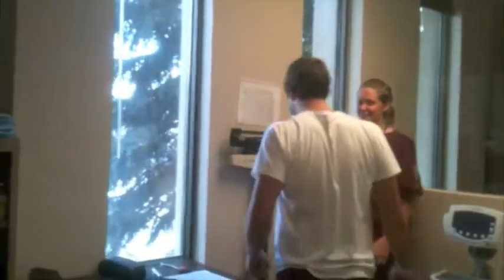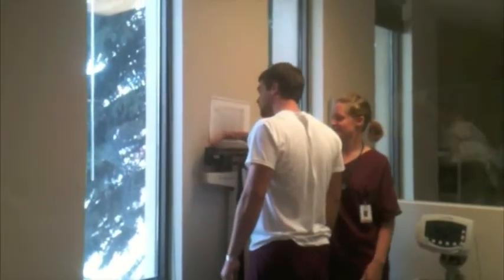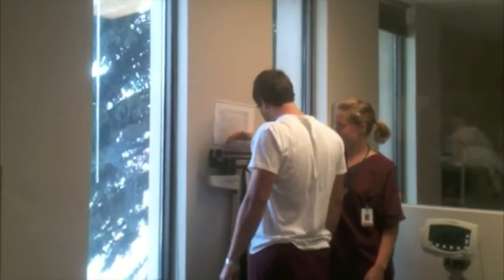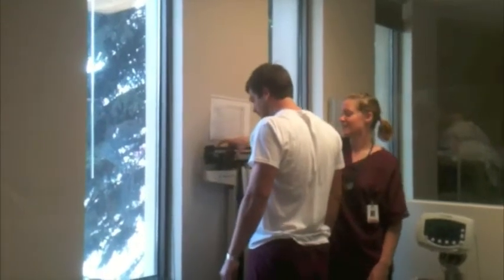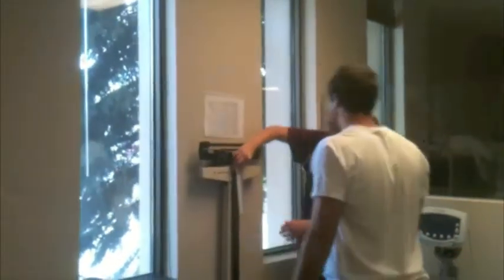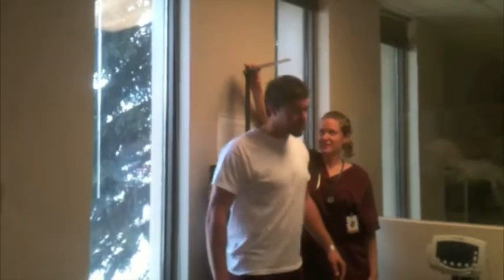She then asks our patient to move to the scale. Here she can determine his weight and height. This will allow her to determine and interpret his BMI. 0 to 18 is below weight. 18 to 24 is normal. 25 to 30 is overweight, and above 30 is obese.